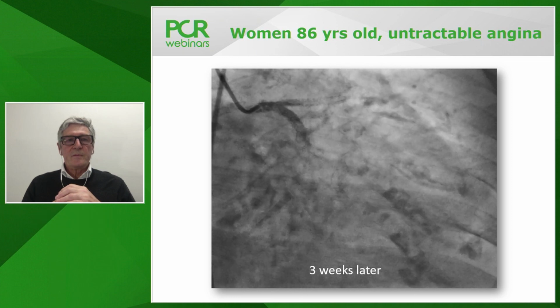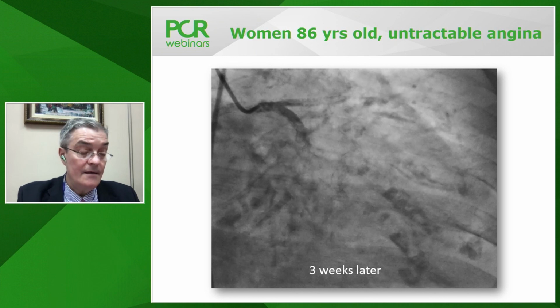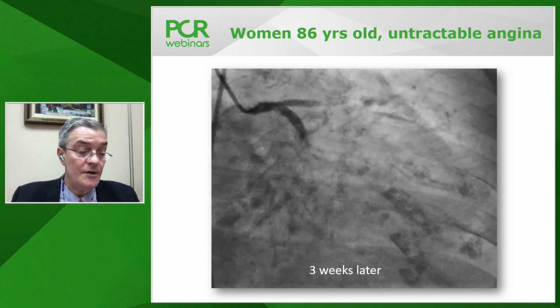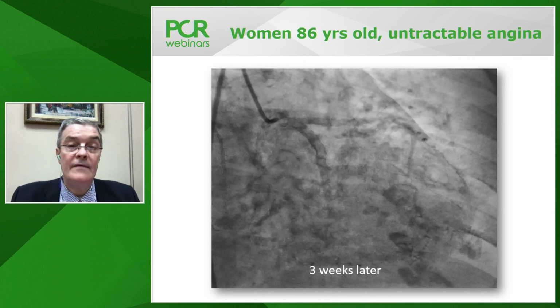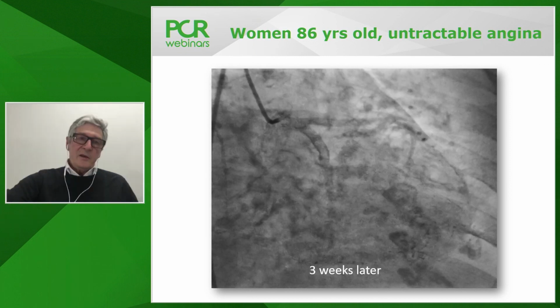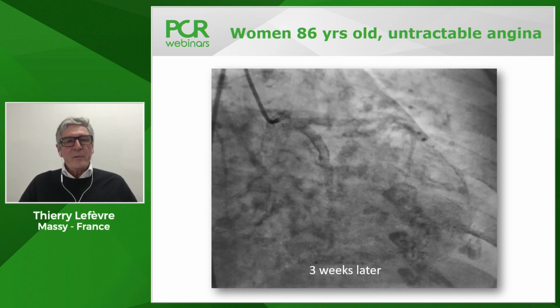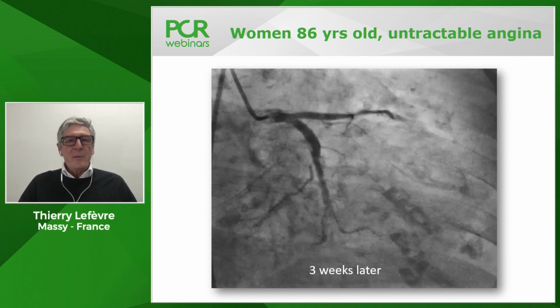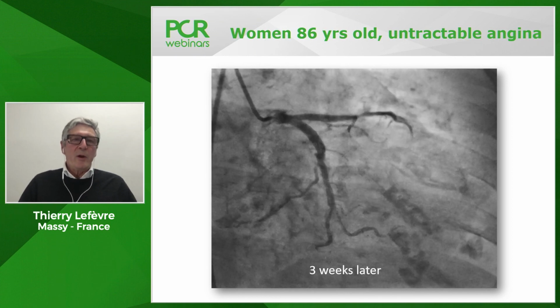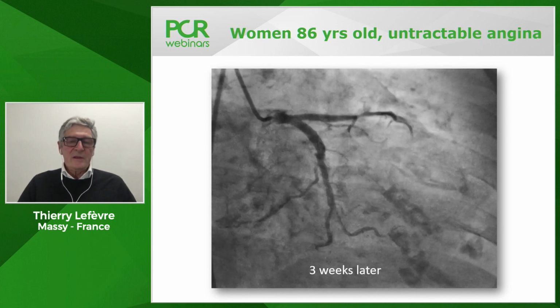Yeah, thanks. Our audience considers you as experts for IVL as well. So there is a question whether the use of IVL will damage the polymer if you use IVL shockwave after stenting. Yeah, it's a very big question, and the company does not like the fact that some operators are using IVL after maldeployment of the stent. We don't know exactly what will be the impact of that.